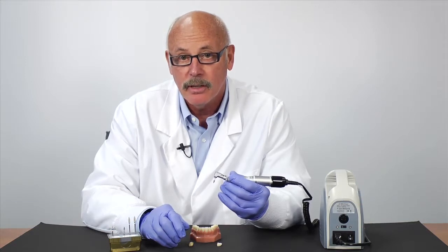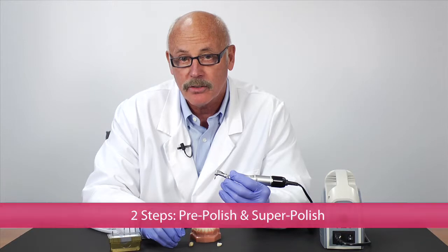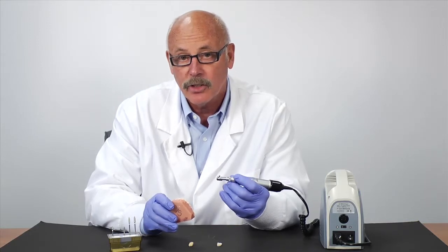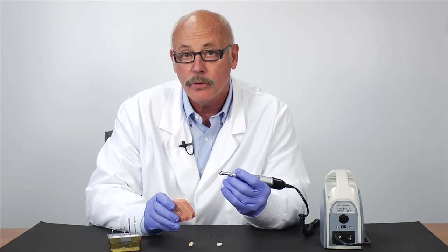Time efficiency and cost savings are achieved when you do the adjustment with Sara Master. When you have adjusted an opposing tooth for crown and bridge, it's easy to take the Sara Master Coarse for pre-finishing and then follow through.